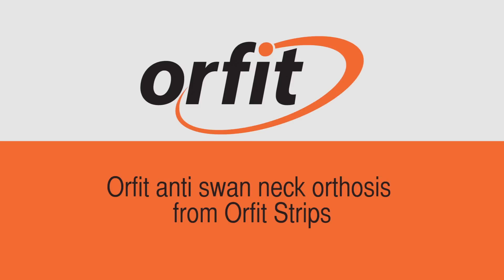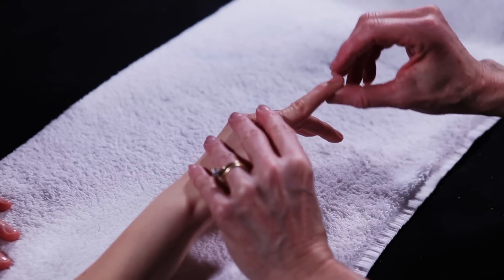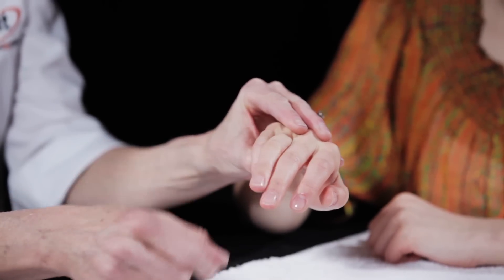Anti-Swan Neck Orthosis from Orphid Strips. This simple anti-Swan neck, or figure-of-8 PIP blocking orthosis, prevents hyperextension of the PIP joint while allowing full active flexion.